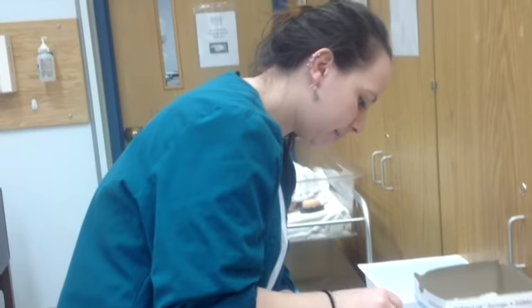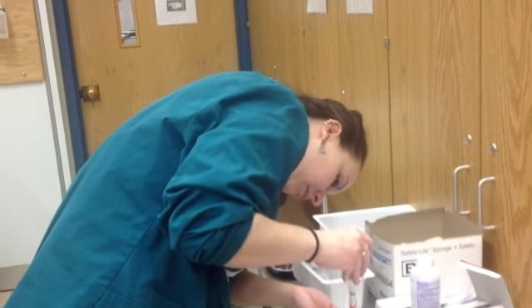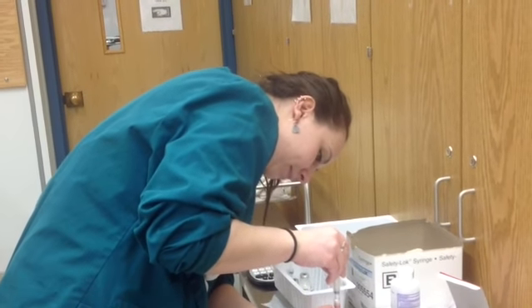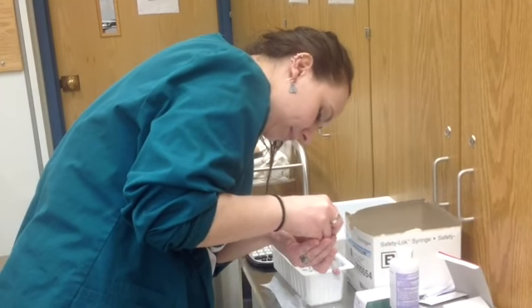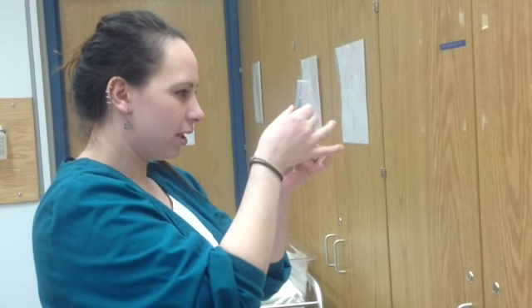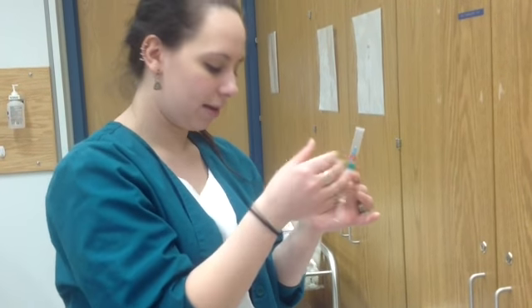Now, I have an air bubble in there, so I'm going to pull the needle out. I'm going to pull the shield down, and then I'm going to just tap out the air bubble so that it's out and doesn't harm your patients.